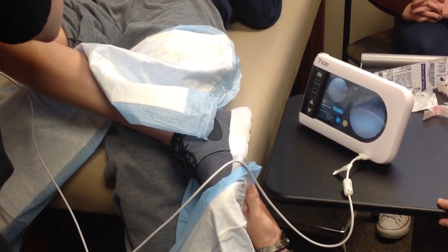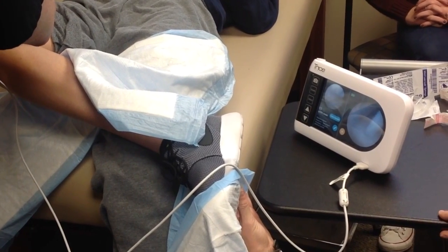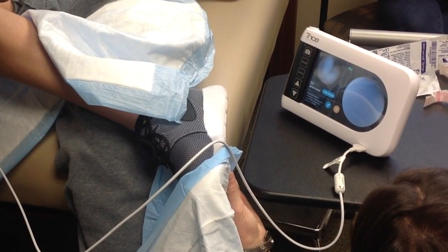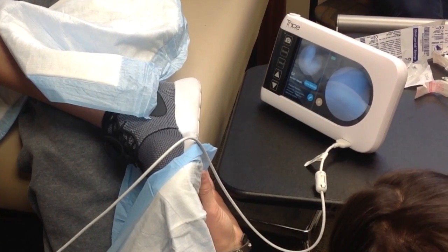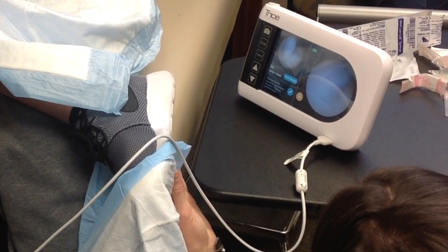This patient had undergone a NovoStitch Plus repair of a radial split of the lateral meniscus. Rather than repeat an MRI, which is far more expensive, we performed this procedure in the office to assess our repair. In this case, it looks excellent. We can also do this primarily instead of obtaining an MRI at the initial visit.